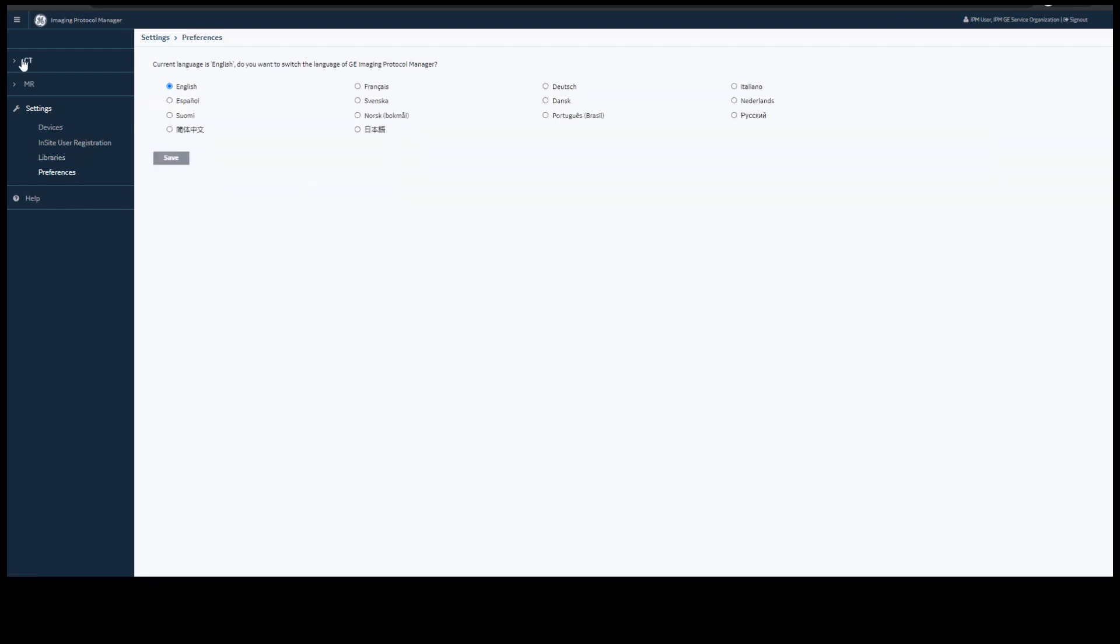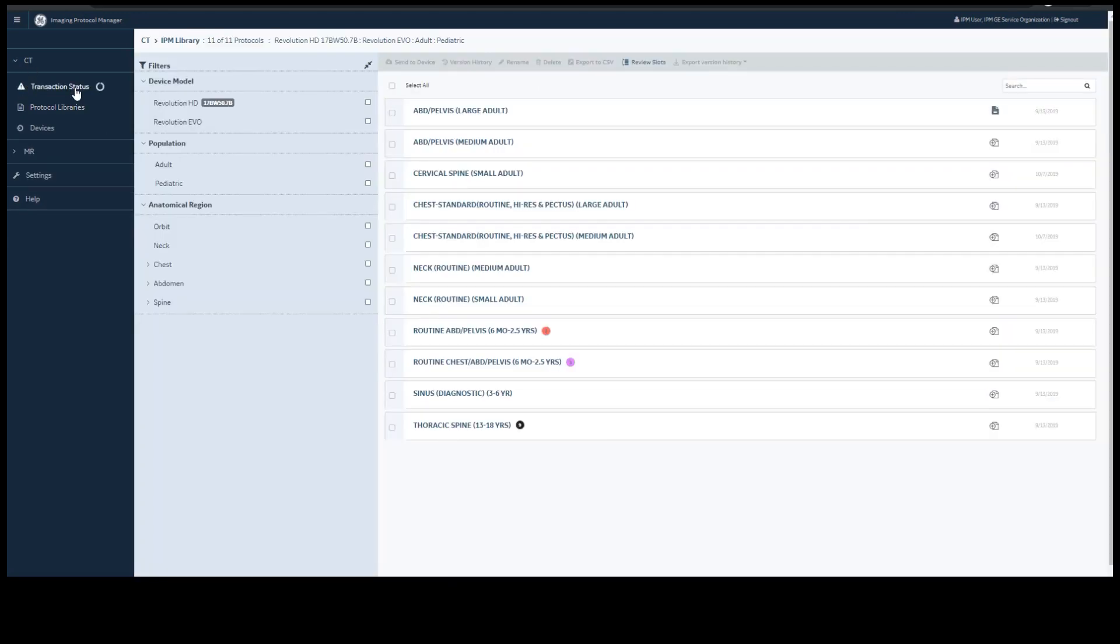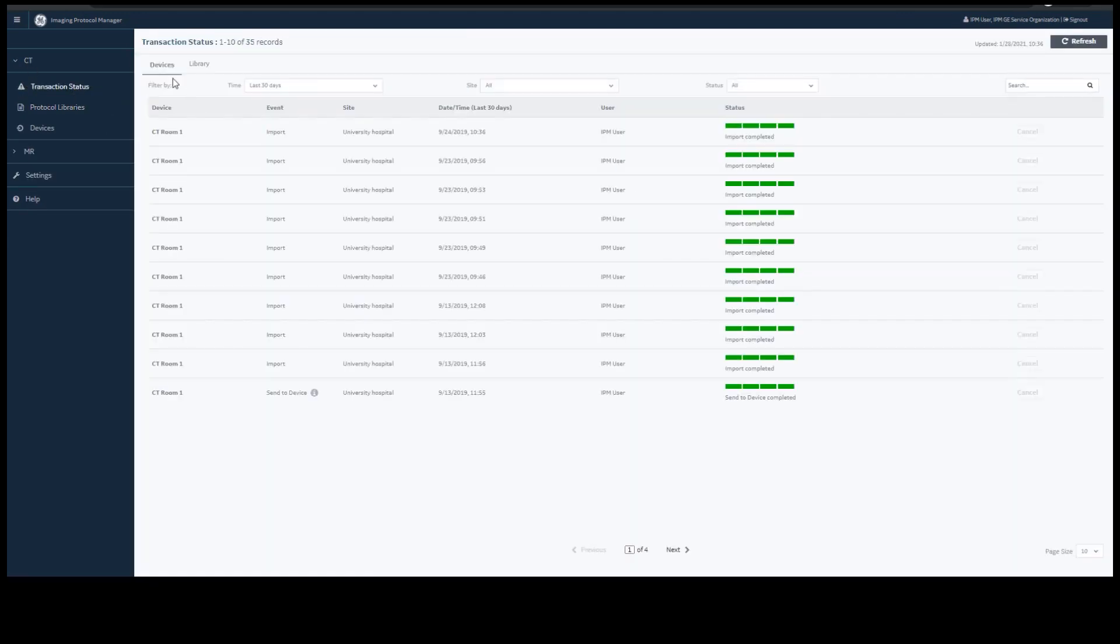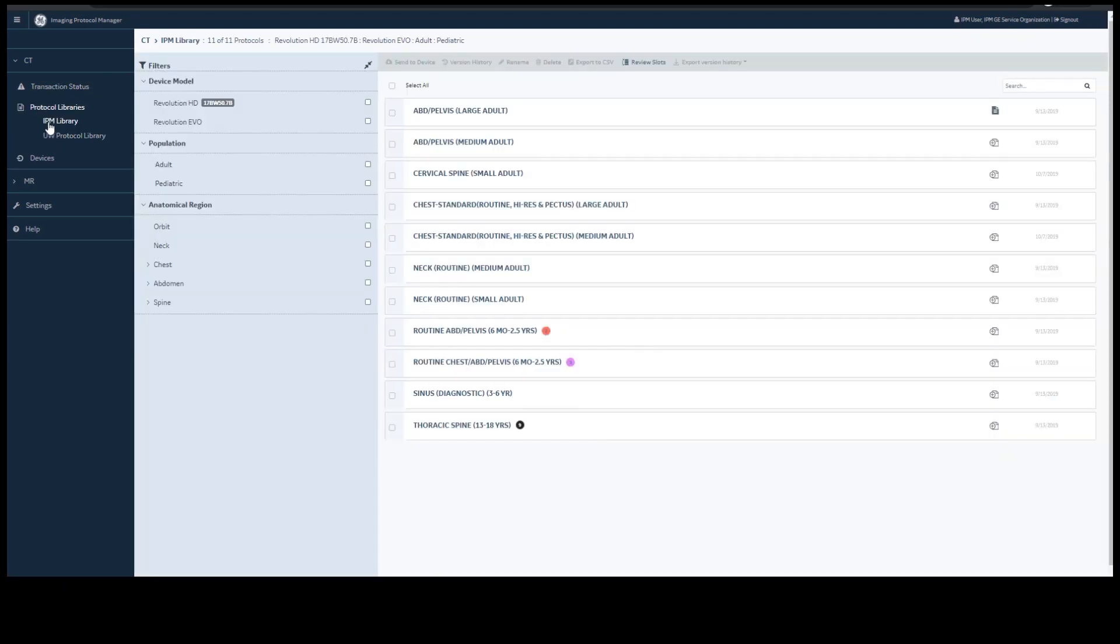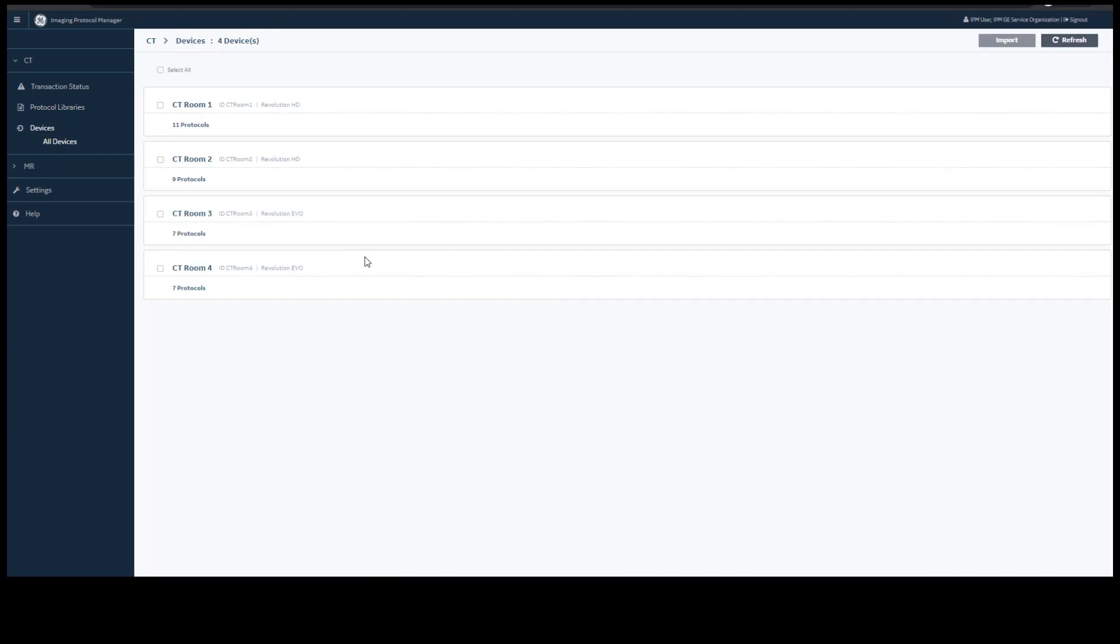Underneath CT and MR, you have Transaction Status which shows you the transactions in the devices and the library. Under Protocol Libraries, you will see all the libraries available to you. Your standard library will always be at the top. Under Devices, you will see all devices that are connected to IPM.